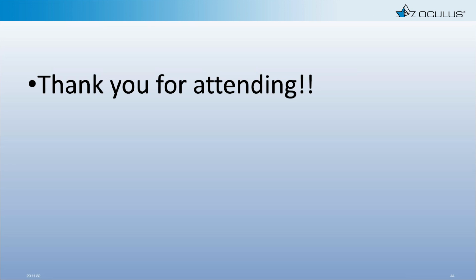So my preference is actually to decide on the diameter lens I'm going to work with, roughly speaking, give or take a half a millimeter, and then approximate where that lens is going to touch down on the eye for the first time, not for the last time, and look at the toricity at that chord diameter, not at the full chord diameter of my lens. And if I've got more than 100 microns of difference between my meridians at that initial touchdown point, that's when I'm looking for something more freeform. If I've got less than 100, I know I'm going to be able to make this thing work with a very basic design. Yes, I might add a little toricity into the haptic part, but I know that a fairly straightforward design is going to work.